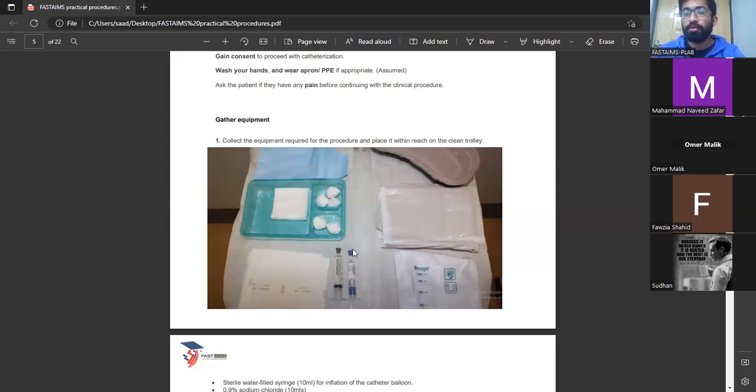The kidney tray would include catheter, local anesthetic, and sterile water. Three things. Again, gallipot, three things. Kidney tray, three things. Now, how to use these three things in the kidney tray? First, put the kidney tray under the penis, so that when you pass the catheter, whatever urine comes out is in the kidney tray. So now the three things. The first thing is catheter, local anesthetic. Give a warning, pass the local anesthetic, and then just verbalize it: I will wait for 3 to 5 minutes.